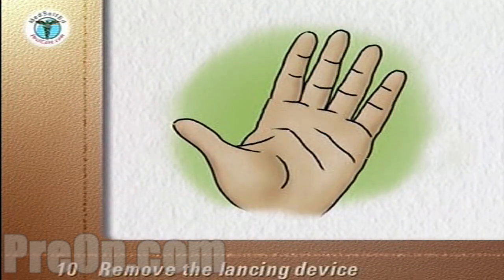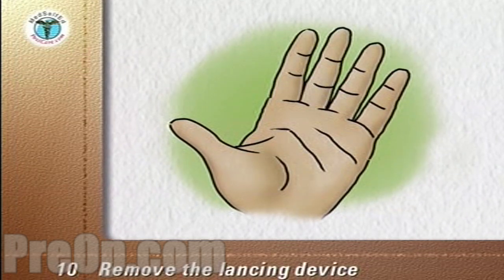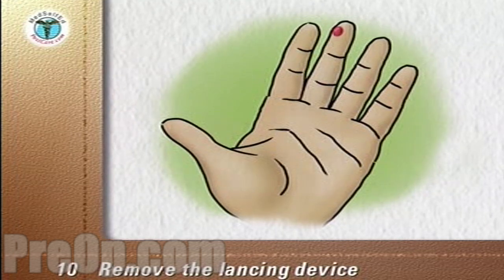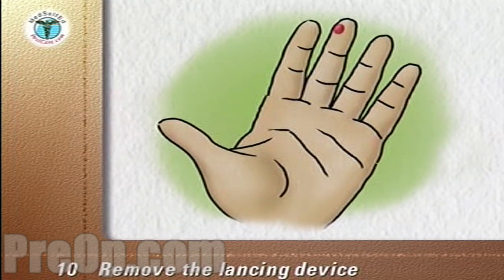After the puncture, remove the lancing device. If a drop of blood does not form on its own, stroke down the finger towards the puncture site without going as far as the site itself.